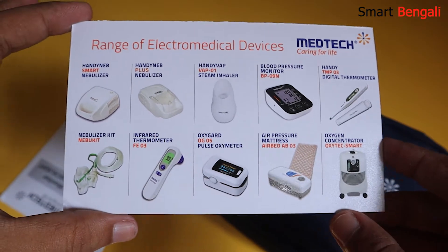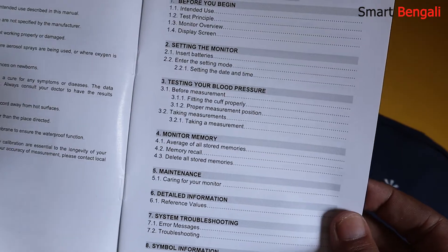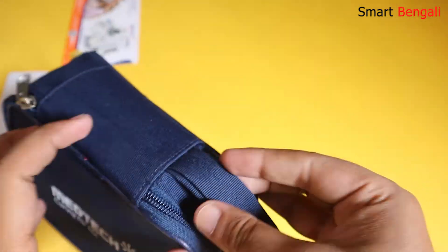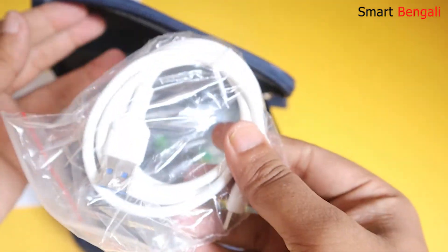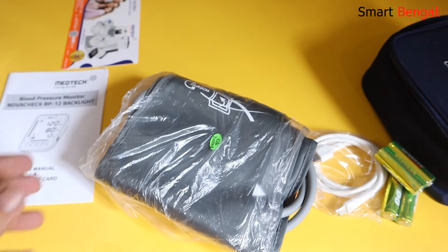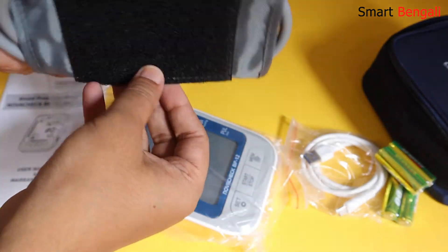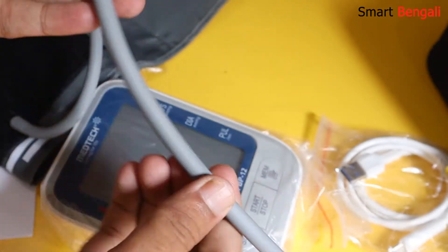Inside the box we have the product catalog, user manual, and warranty card. There is also a bag so that you can carry it easily — the quality of the bag is decent. We also have the Type-C cable, 4 AA batteries, and the main device. Let's check the cuff quality — it seems the quality is good, with a very firm velcro strap and a soft tube made of good quality rubber.